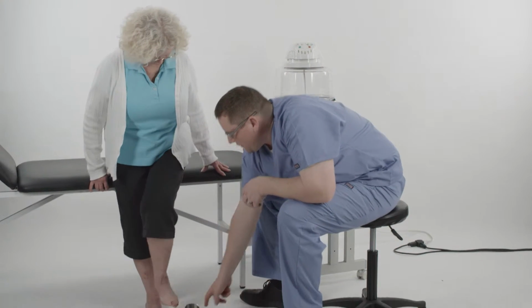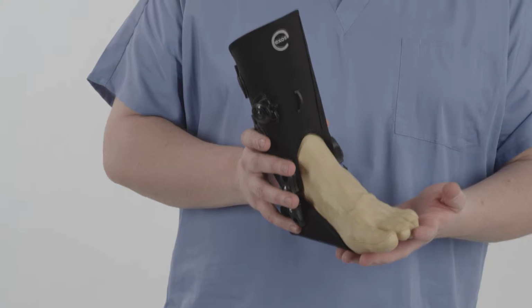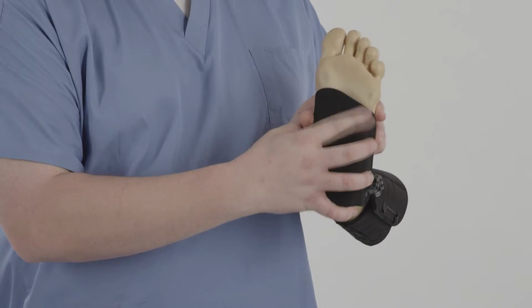If using a brannock, while the patient is standing, measure their foot for proper size. The key is to ensure the footplate of the Exos free motion ankle will hit just below the metatarsal heads.